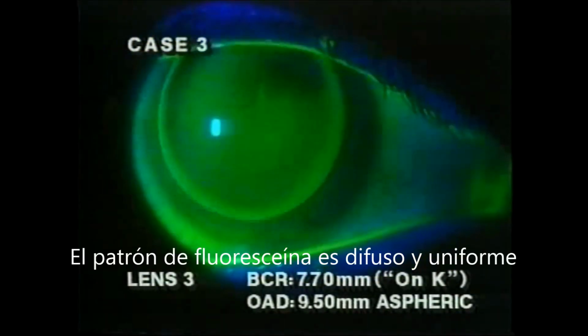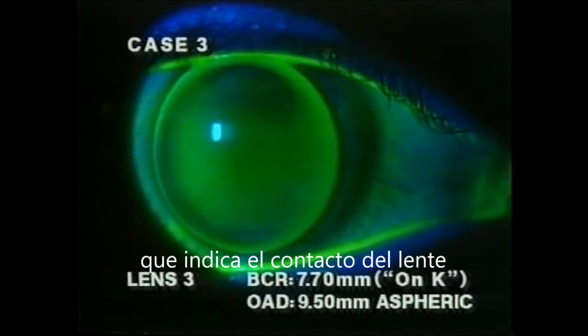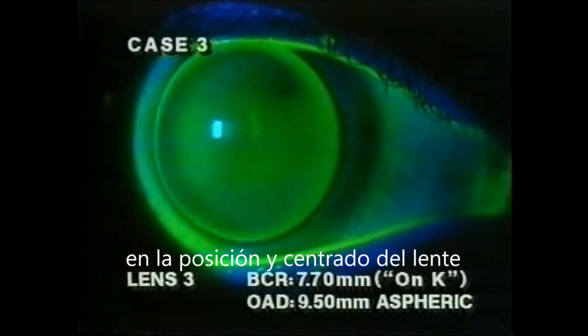The fluorescein pattern is diffuse and uniform. This alignment fit is attributed to the aspheric design, which exhibits gradual flattening from the center to the periphery of the lens. A moderate amount of against the rule astigmatism presents a challenge in providing a well-centering rigid lens.